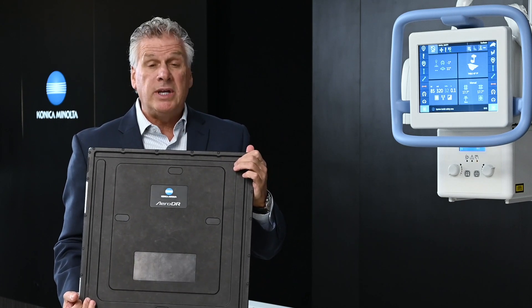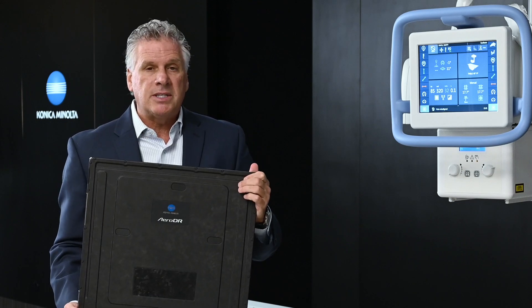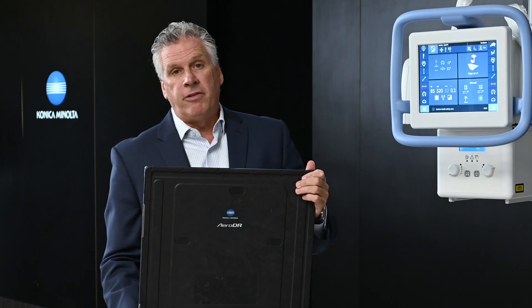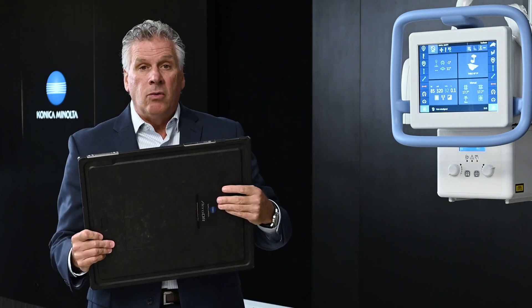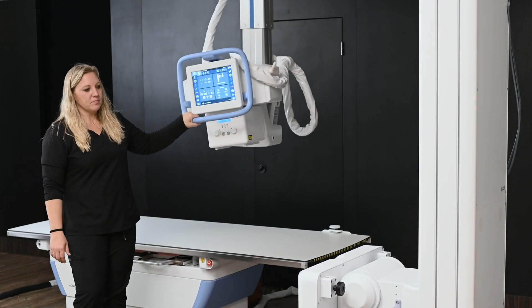These detectors are capable of doing DDR. With the ability to integrate a 17x17 detector into our Flex overhead tube crane in the upright, and add a glassless detector for the table, we've essentially created the world's most advanced x-ray room — able to do imaging, motion, flex and extension work for DDR, and all your general x-ray work. Truly the most comprehensive overhead tube crane ever established in the marketplace today.